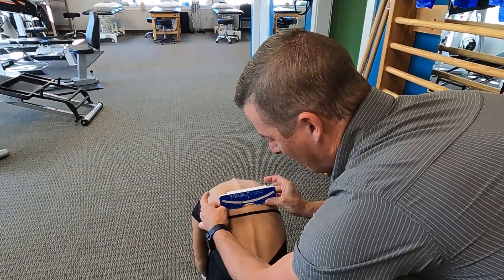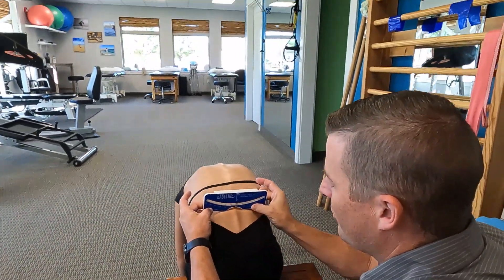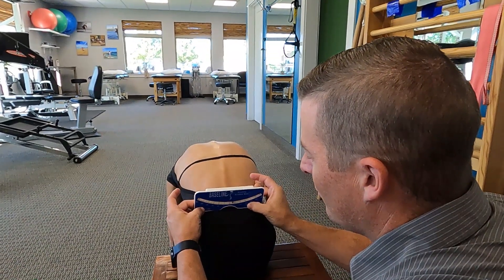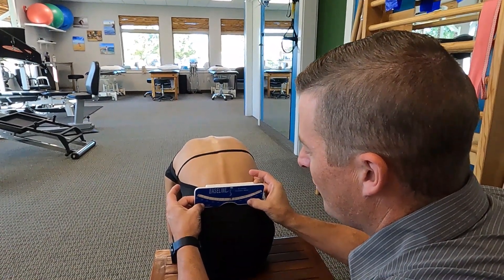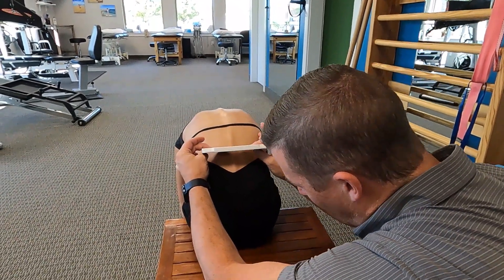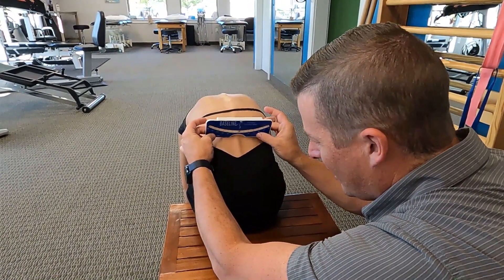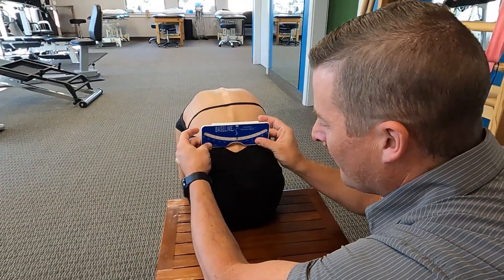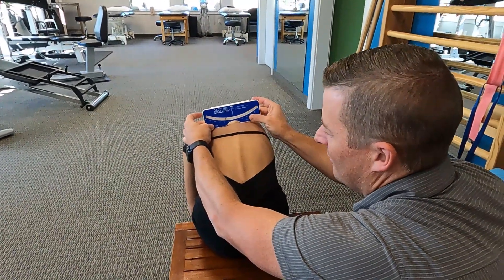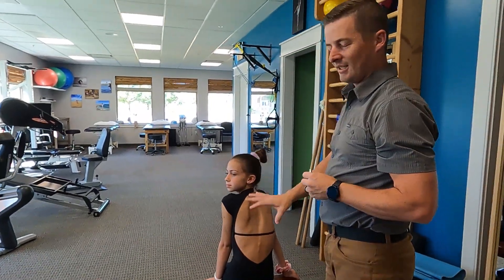We're about eight degrees there, and then it starts to go back. Then we'll come down into the lumbar spine. Remember, both hands on the scoliometer. We might get two or three degrees through here. One thing to note: don't go too far sideways, because then it won't be an accurate reading. We want to keep it upright and vertical — both hands on the scoliometer, taking the highest reading. Go ahead and come up, Sammy. So that's how we do it in sitting.